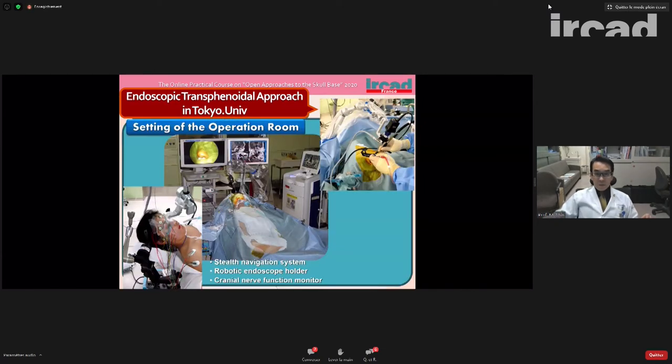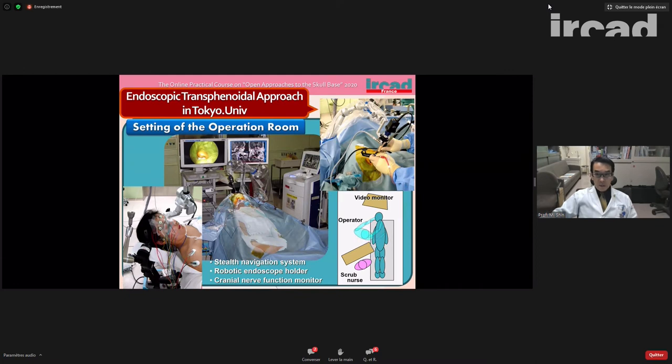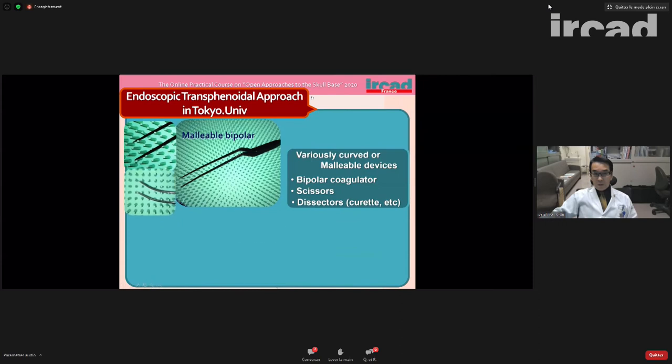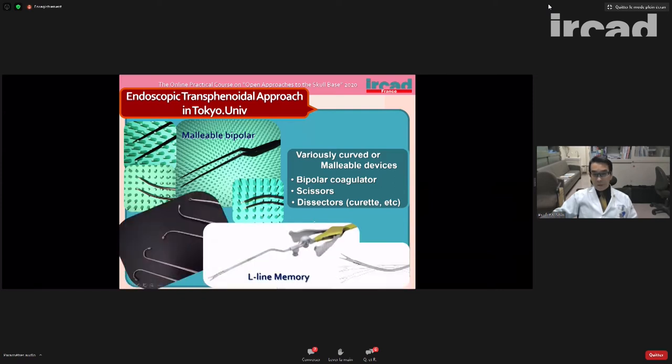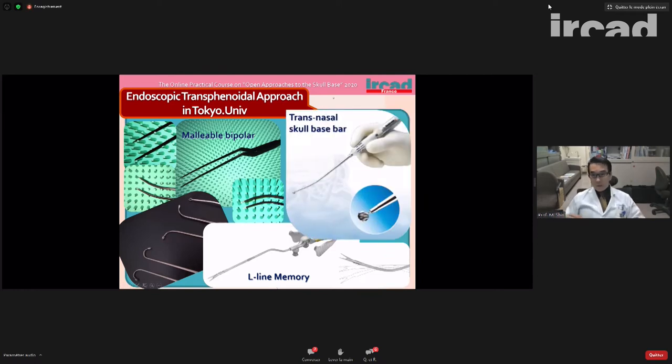And in our method, we do surgery with one surgeon and one scrub nurse. We use stealth navigation and a Mitaka holder and also cranial nerve monitoring. And we use various curved malleable devices like bipolar, also malleable, and various dissectors and scissors are also malleable. And we usually use this curved transnasal burr, a Medtronic Midas Rex.